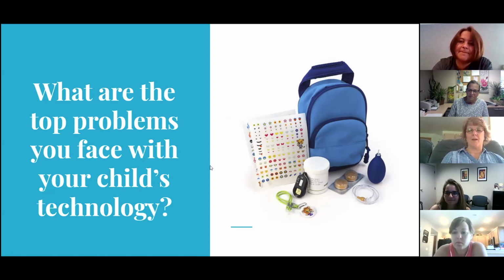We had a lot of that when my oldest, this is Brenda again, was in marching band. We had just a lot of issues. At one point we tried some different covers for them, although they're more water resistant than they used to be. But I think that's common, especially in the summer. The other thing sometimes is with the equipment at school, was it the receiver or was it the aid? Trying to figure that out. It's definitely a thing. Thank you.